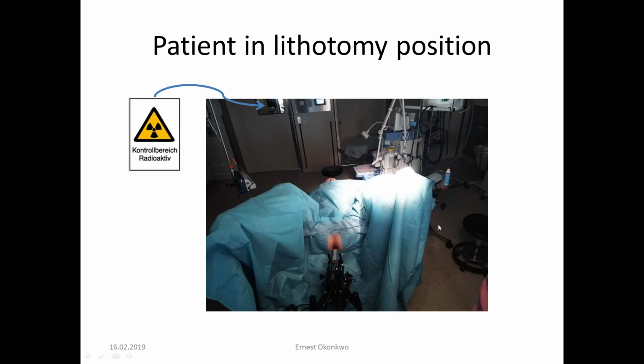This is an example of a patient that we treated some time ago, lying in the lithotomy position. It's also important, and the ordinance also states that once we are performing this procedure, the room is the control area.